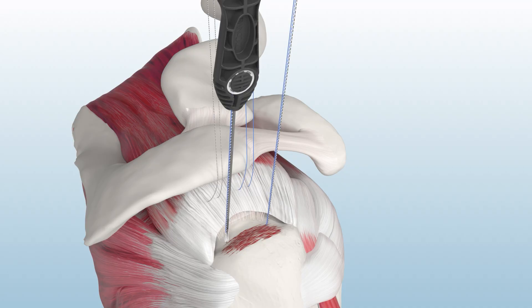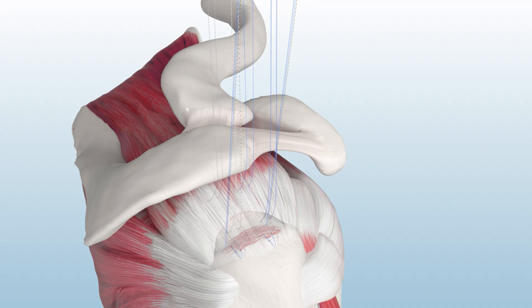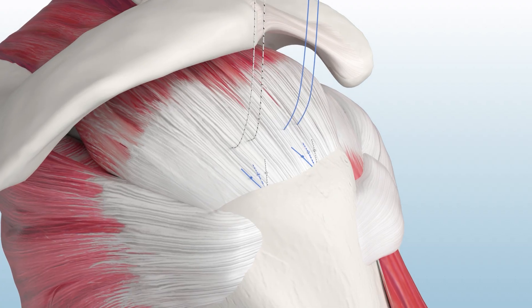Then, insert two Y-Knot Pro RC all suture anchors and complete the primary repair, as you typically would.